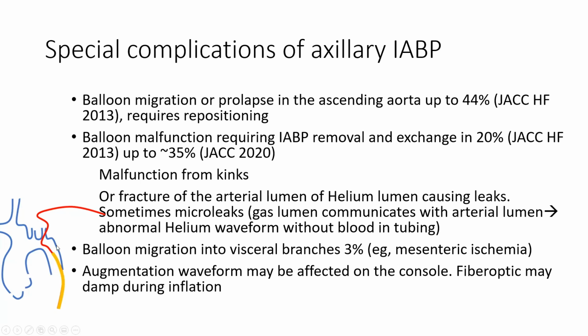This is particularly the case if the balloon pump is large compared to the aorta and is filling it very fully, occluding it and opposed to it during each inflation. Frequently, that doesn't happen. You still get a decent augmentation waveform, but keep in mind, if you have a bad augmentation waveform, it may not be that there is a problem. It's just because you're monitoring the distal aorta.